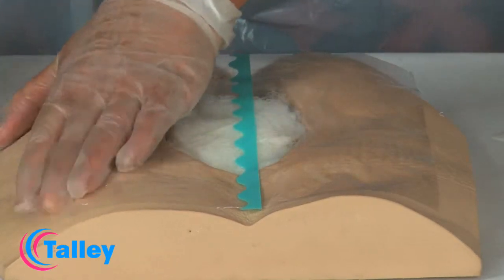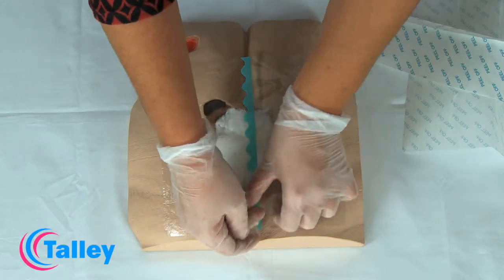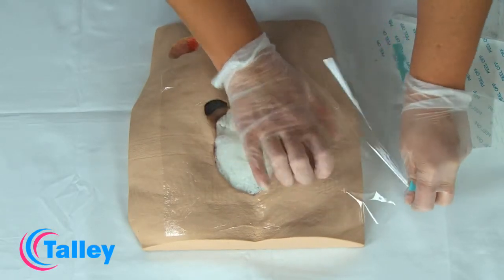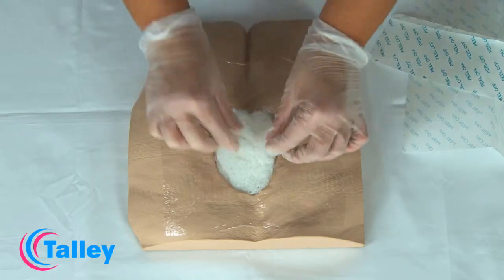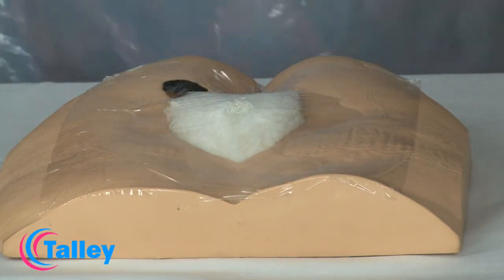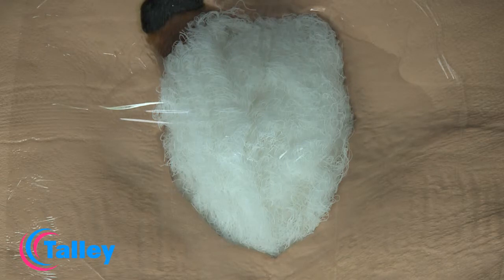Place the transparent film dressing over the filled wound, ensuring contact with at least 2.5 cm of intact skin beyond the wound edges. Lift the transparent dressing lightly with the thumb and forefinger and cut an oval-shaped hole, approximately 1 cm in diameter, over the gauze, taking care not to cut into the gauze.